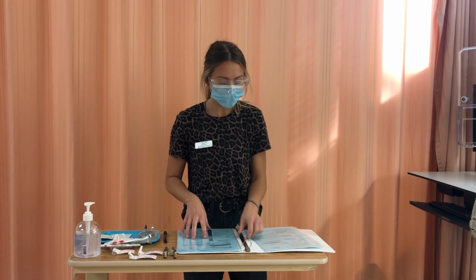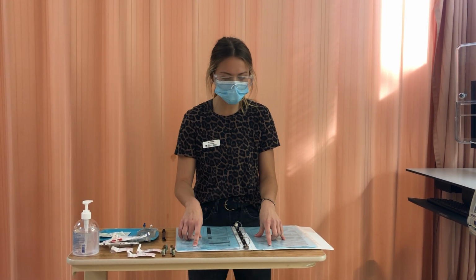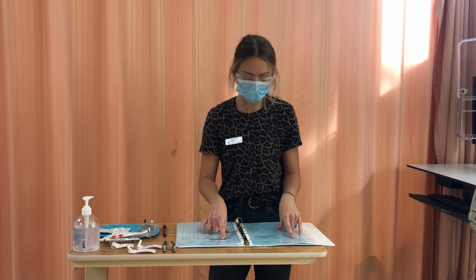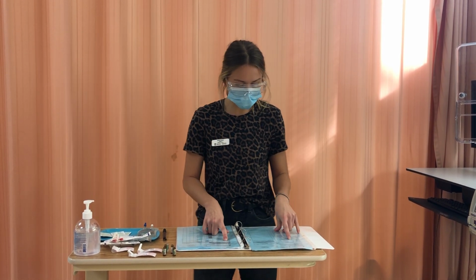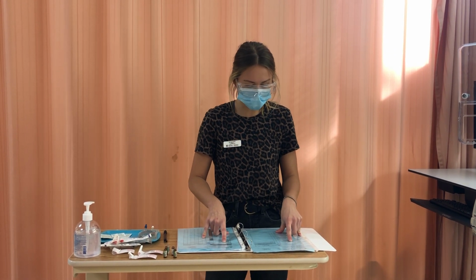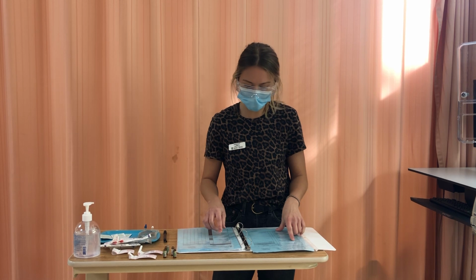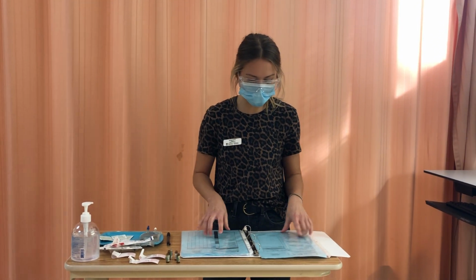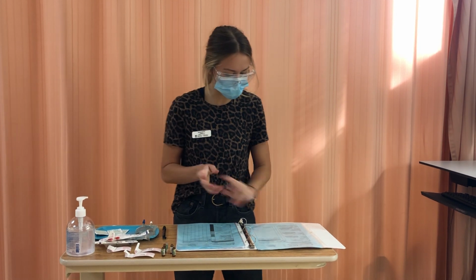with my MAR. So my right patient is Marcy, FIN number 123456789. There's no known allergies. And the right medication that's ordered is morphine 1 milligram per ml. The dose is 1 milligram. The lockout interval is every 5 minutes, and the right time is now, and the right route is PCA. So that looks good. It's been signed off.